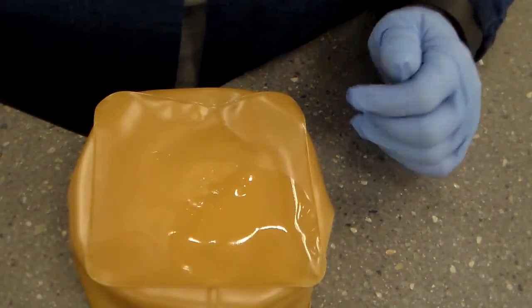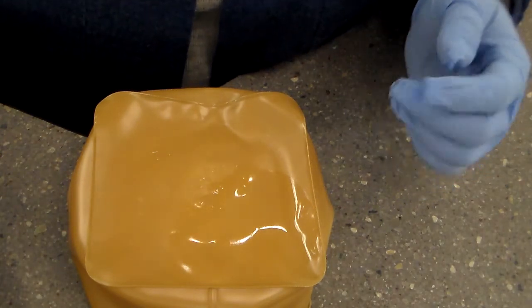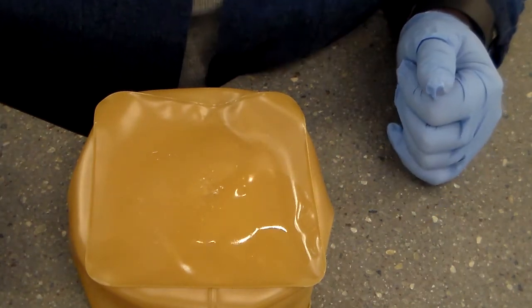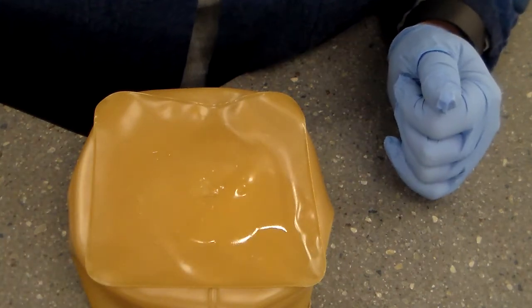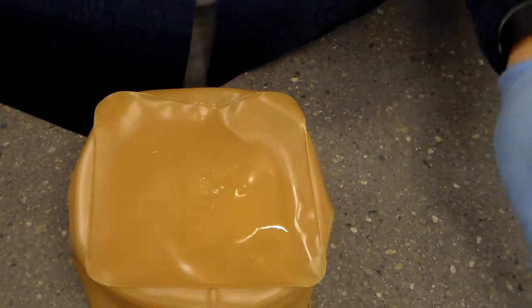We're going to use the alcohol. We're going to give it a chance to dry. The more time that the alcohol is on the skin, the more microbes that it is killing, so less likely to have any type of infection at the site. Alright, so we have our medication and we are going to inject.